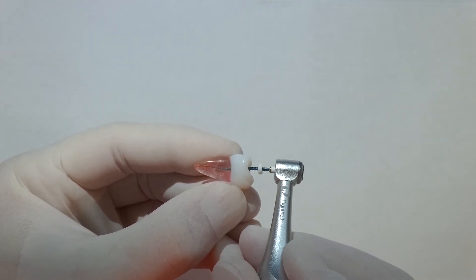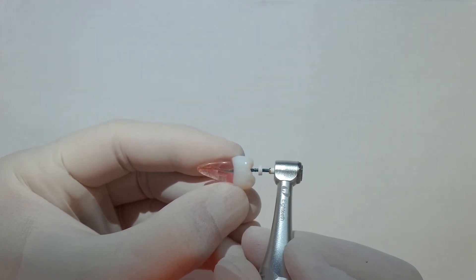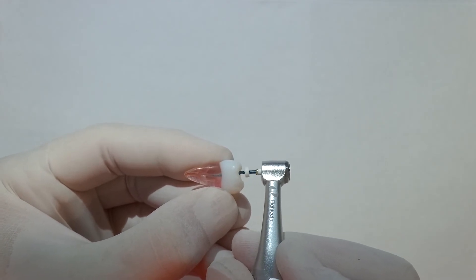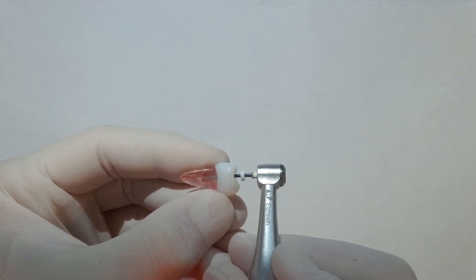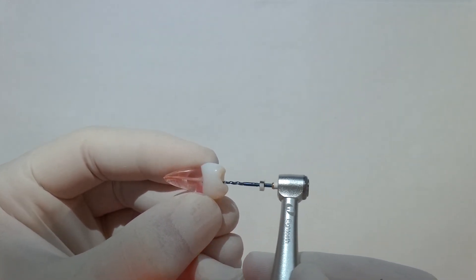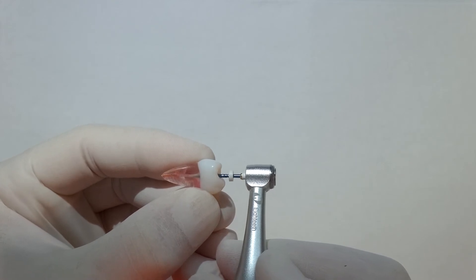Again, you can do a little bit of brushing here if you want to, just to increase that straight line access. Exactly the same with the last file, once we've reached that stopper, once that gets to the working length, its work is done, it's completely shaped. If you just want to refine that coronal part again a little bit more, you can.